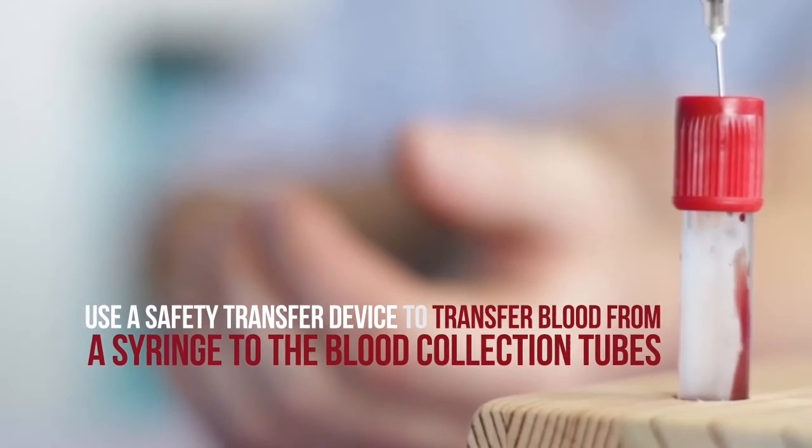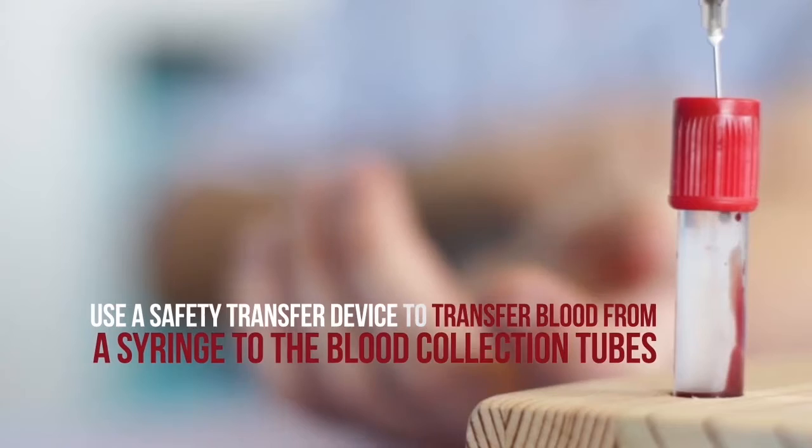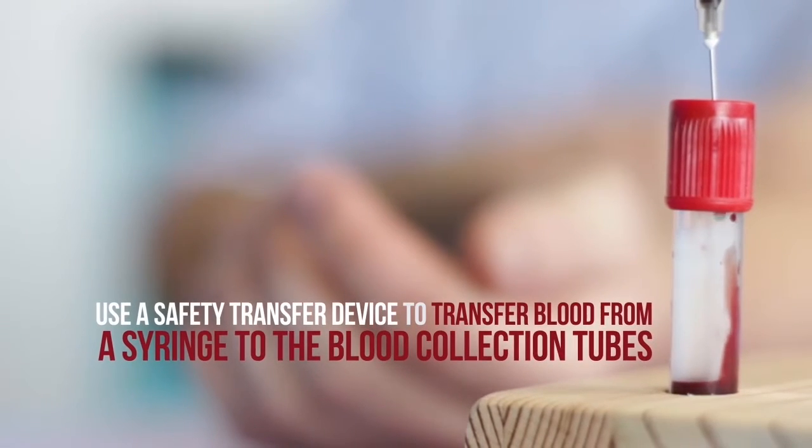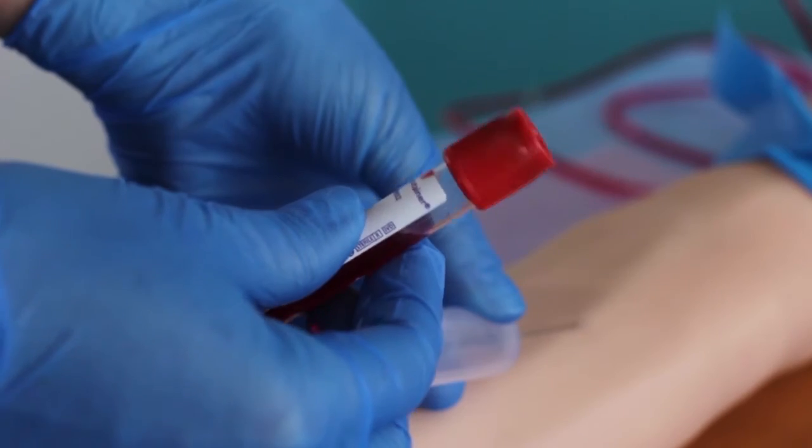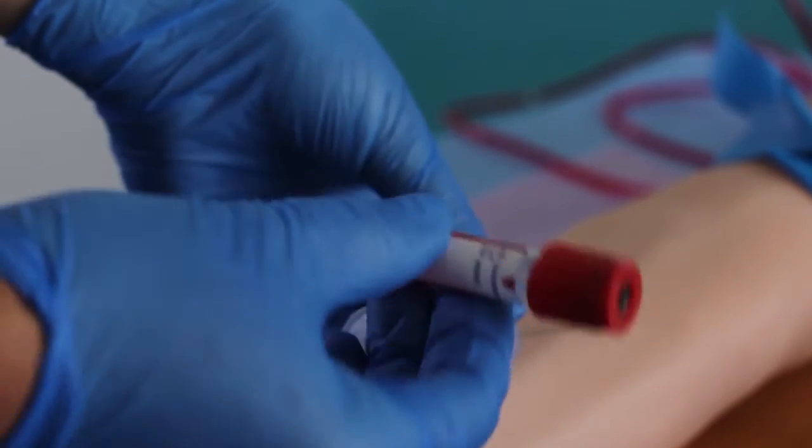Use a safety transfer device, not included in the kit, to transfer blood from the syringe to the blood collection tubes. If the tube used has additives, mix the contents by gently inverting the tube 5 to 8 times.